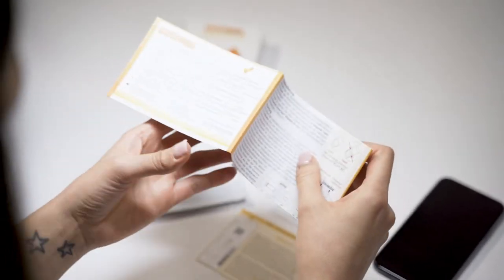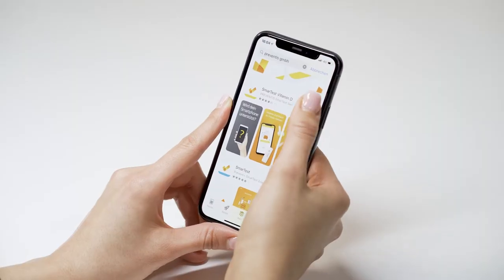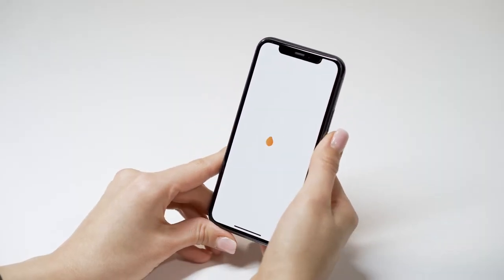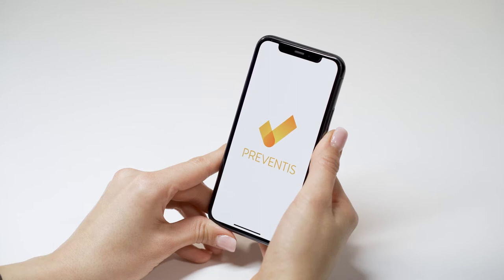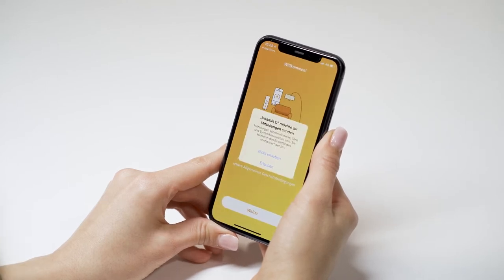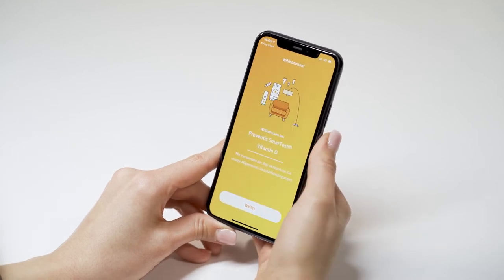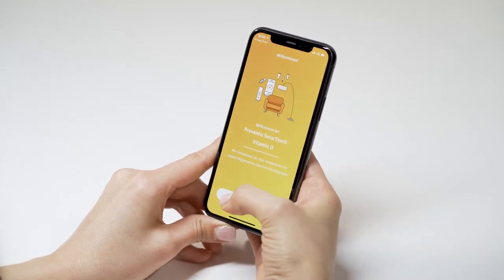Carefully read the enclosed test instructions before launching the app and starting to test. Now start the app and perform the camera test. It is important to perform the camera test at the same location where you will later evaluate the quick test — this is the only way to have the correct lighting conditions in the test.